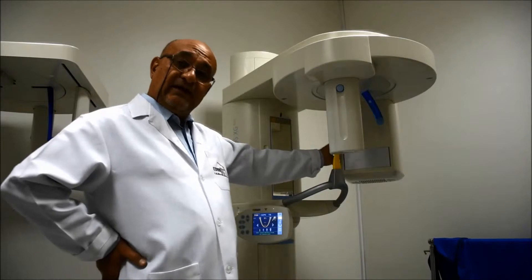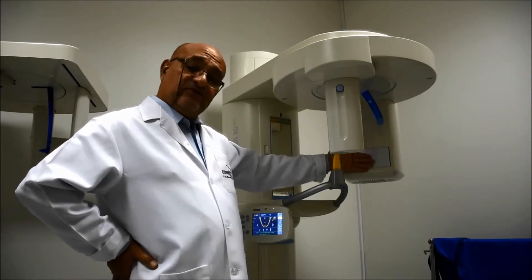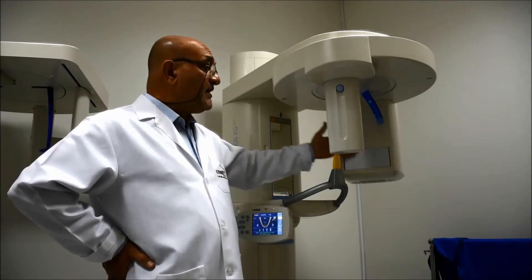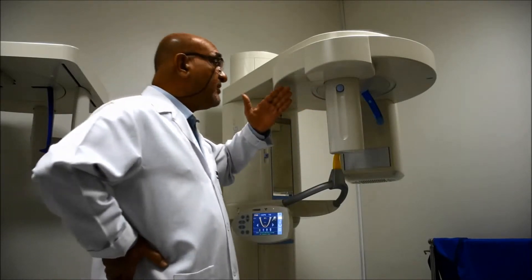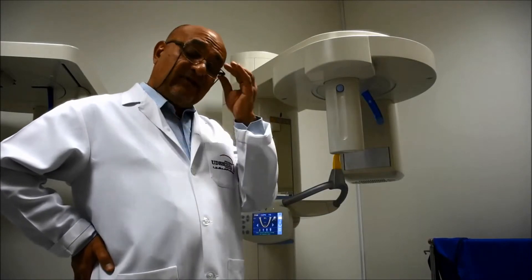This is the x-ray head, where the x-ray is going to be generated. This is the collimator, which is going to collimate the beam into a slit type of x-ray. This is the image sensor, which is going to capture the image, and the image will be transferred via a cable to the computer where we have activated the exposure.